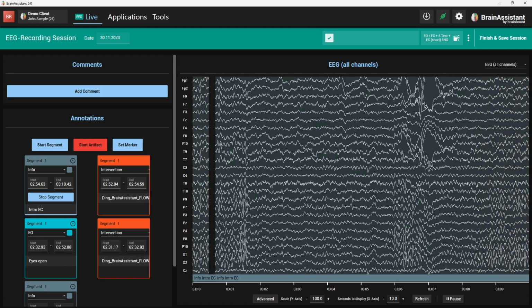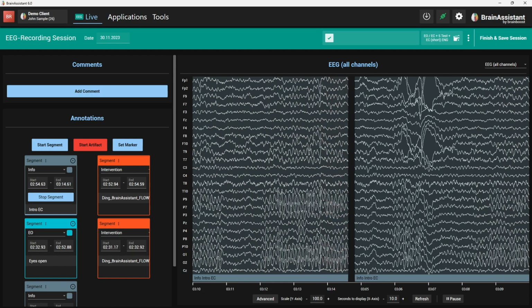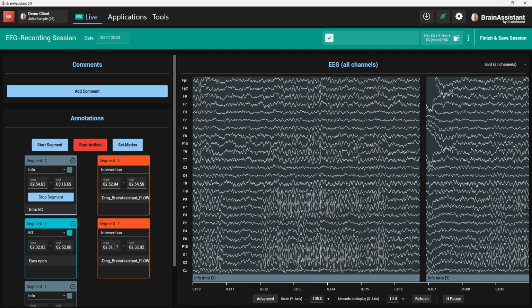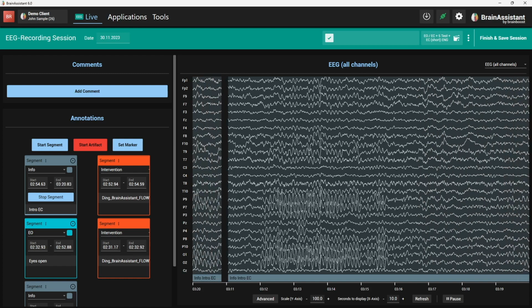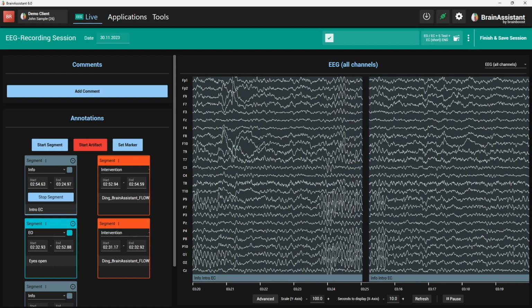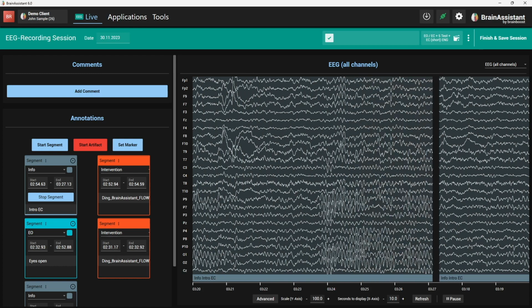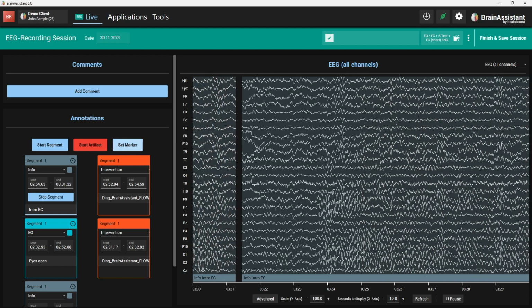So why do we have those sounds? You can delete those, but I need them so the client also knows, once I hear that sound, the measurement is over, they maybe want to stretch. So I kind of have them all ready for what's going to happen or what is happening now. So yeah, I never lose control when they turn their heads, create artifacts, etc. So I didn't press anything, just A from the view of a client. So this is pretty sweet.